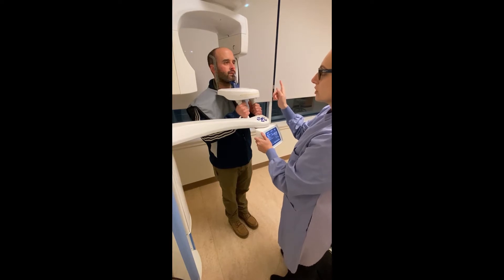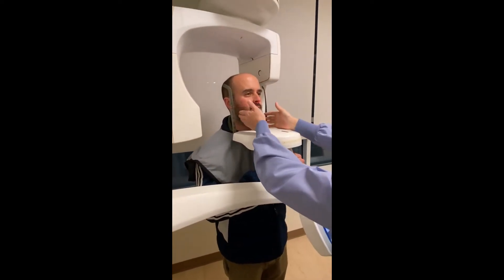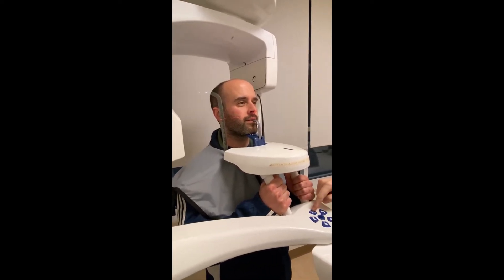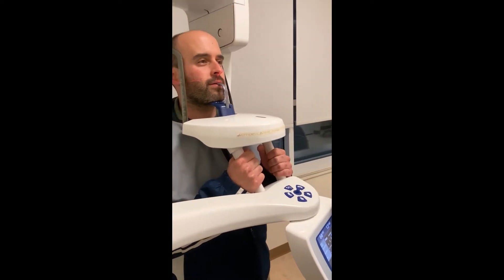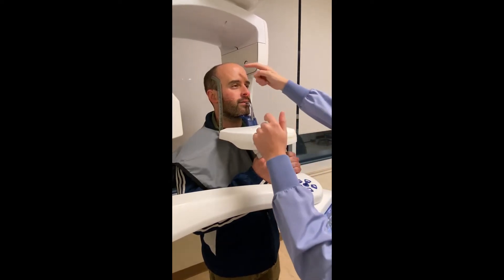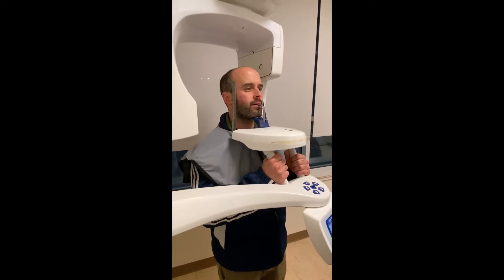Once you have the proper body positioning, you're ready to line your lasers up. The first laser to focus on is the midline laser. Press the button at the top to close the temporal headrests, which will automatically close around the patient's temples. If the midline was slightly affected, carefully inch the patient over until they are divided appropriately.